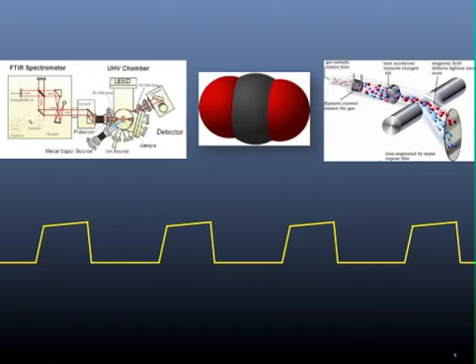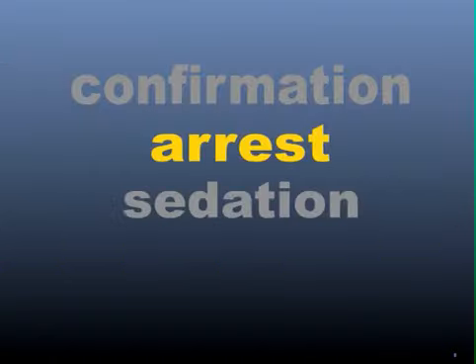And if you get an intubated patient with AMS, just pop in the capnograph, bag once, you see a waveform, no more guessing. No messing around with trying to get repeat DL with the tube in the way if you can't see anything. Just pop it on, bag once.